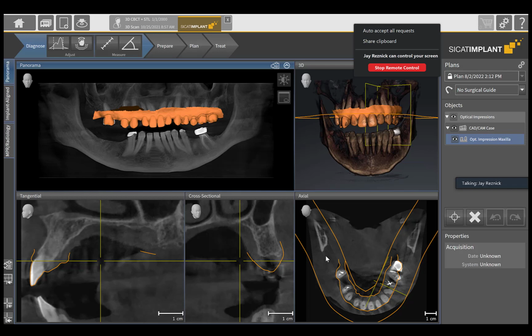Okay. With an SSI file that contains the crown, with an STL, can you still make a proper surgical guide without the crown? Yeah, you don't need the crown. You can still upload your order. You can't export the SSI out of CEREC unless you've made a crown. Sure. But you can import that into the implant planning software. And the important thing is that you have the STL file of the dental surface of your teeth.